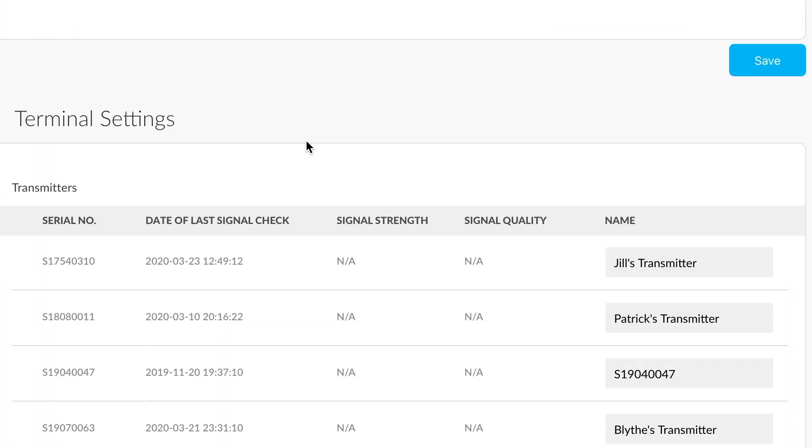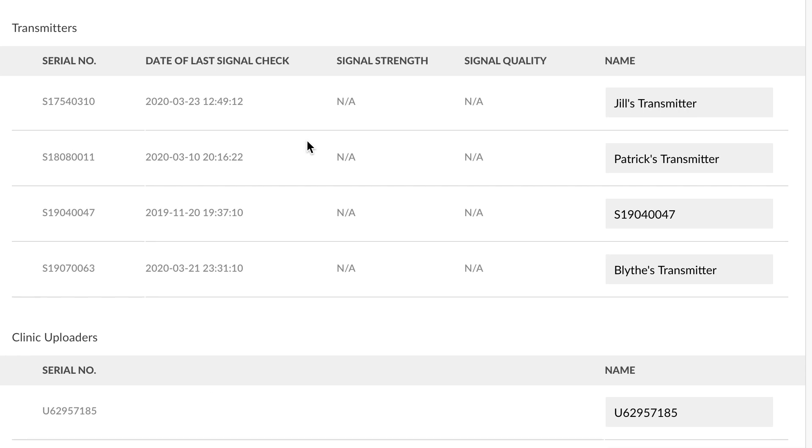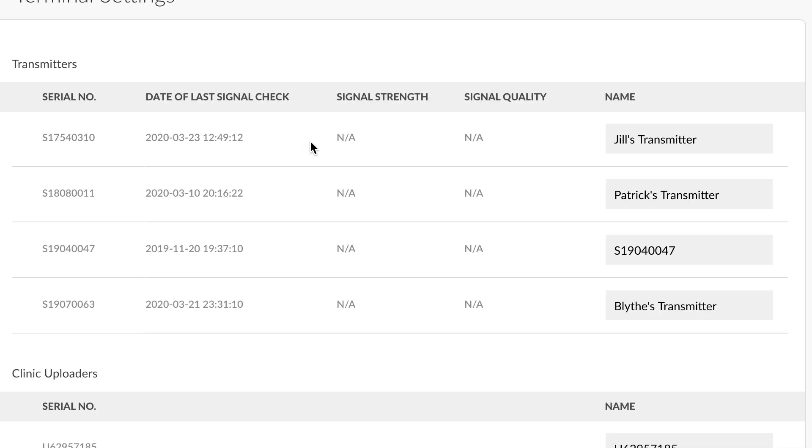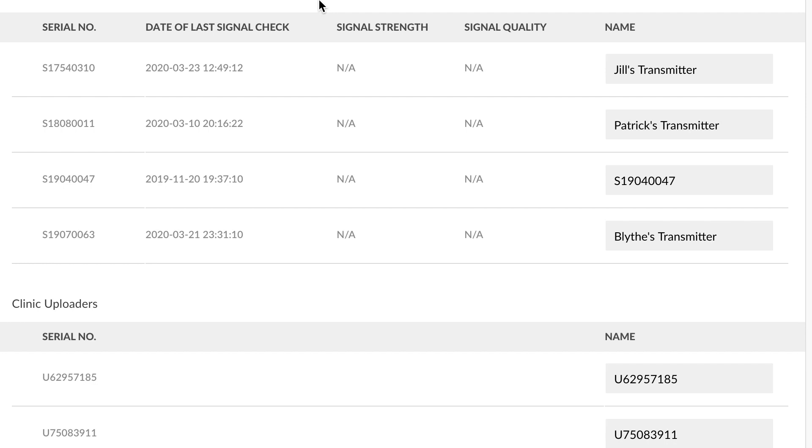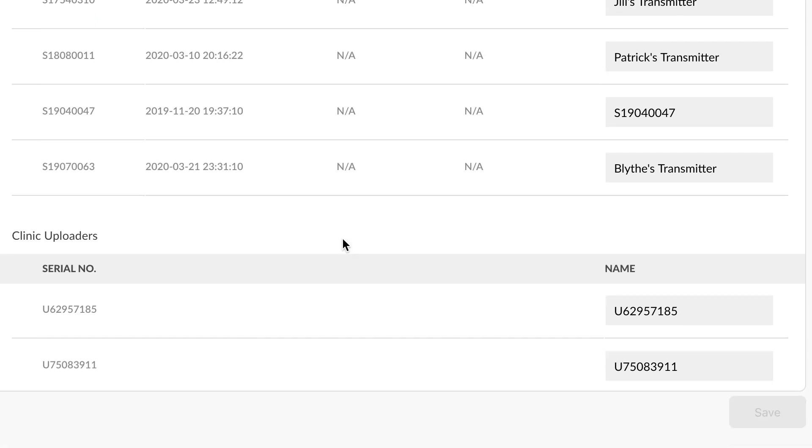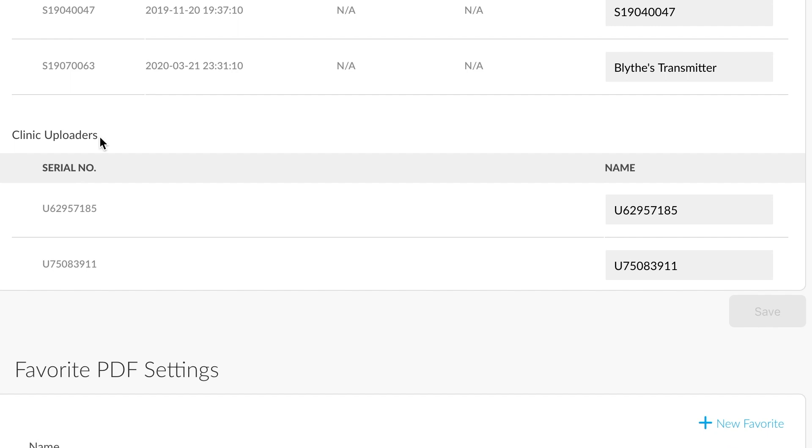Scrolling down to Terminal Settings allows us to make changes to the terminals we have associated with our account. What we consider terminals are the transmitters or the gluco uploader software that resides on your computer. For instance, right here, this serial number is tied to Jill's transmitter. If we wanted to modify the name, we could do so here. Scrolling down here, you'll see that there are clinic uploader terminals. And we could also modify the name here if we needed to.